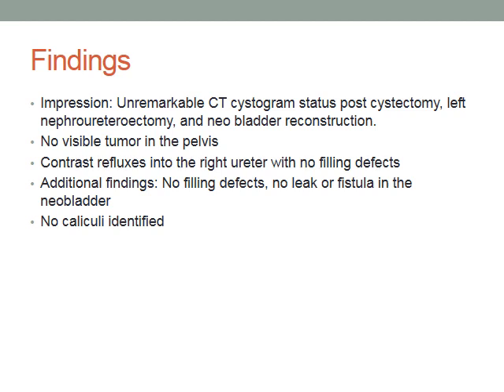Basically, the impression is an unremarkable CT cystogram, status post-surgery. No visible tumor identified in the pelvis in this patient with known recurrent urothelial carcinoma at the level of the urethra.